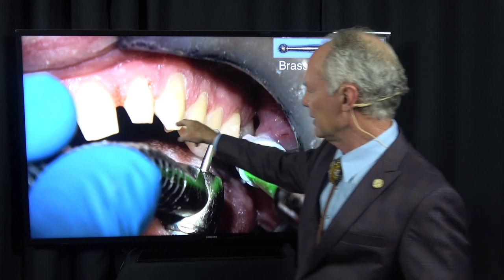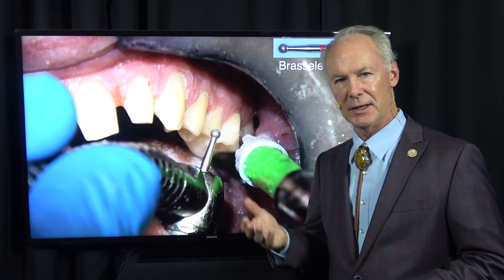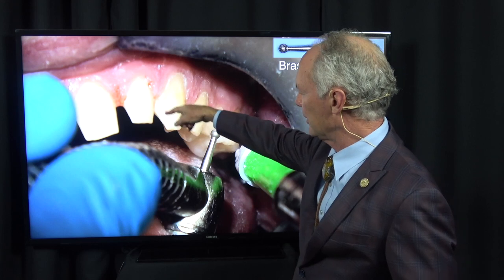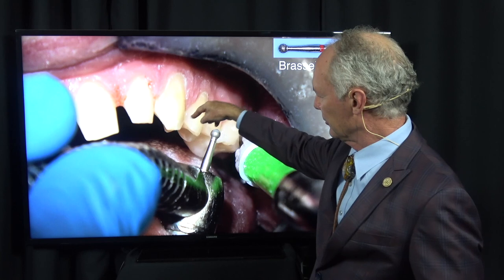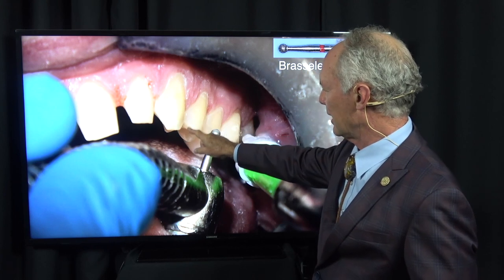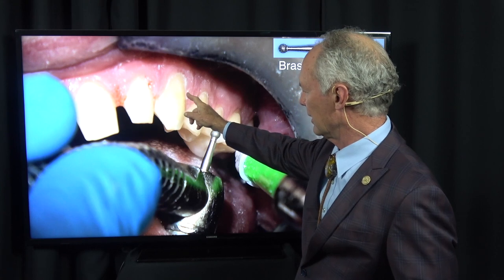Now all the anterior teeth, the cuspid and the laterals and the central incisors, have a stop on the incisal edge because you're prepping the incisal edge. That incisal edge is going to be flat so that the incisal palatal line angle is 90 degrees. Then you're going to round the incisal facial line angle and the interproximal facial line angles.